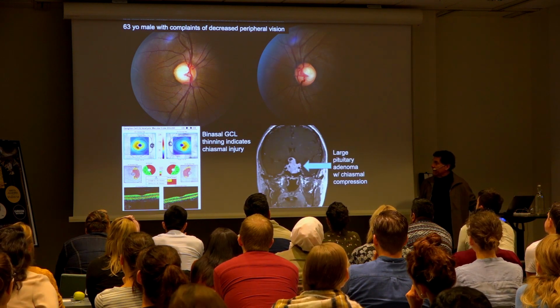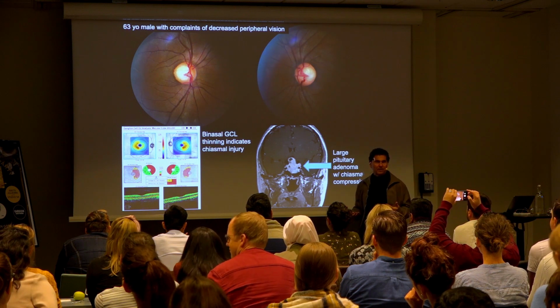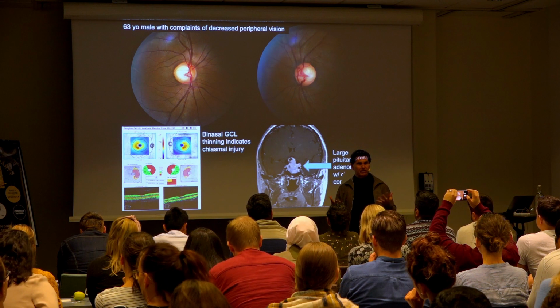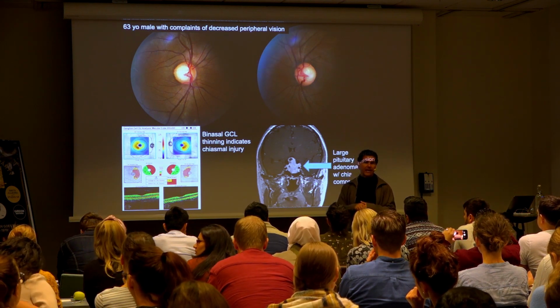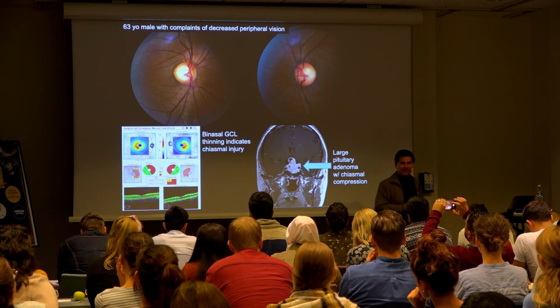So, yeah, this is a typical one where they're stuck in the glaucoma clinic for a while, then finally, either because the visual field's starting to show something more obvious or someone gets a ganglion cell layer analysis. You didn't appreciate that with the nerve fiber layer analysis, right? That could be glaucoma.